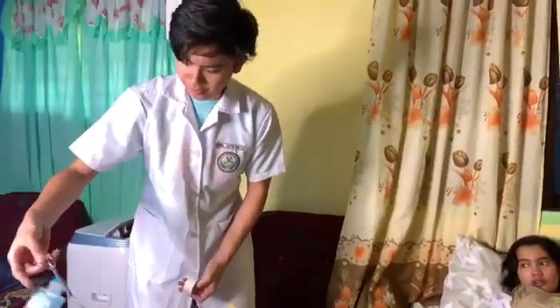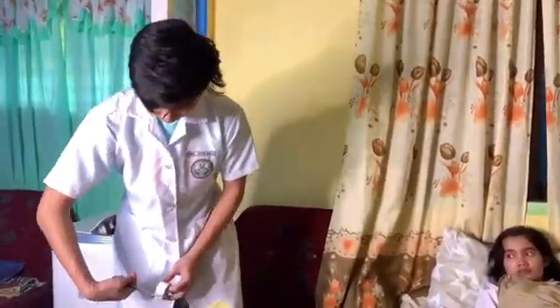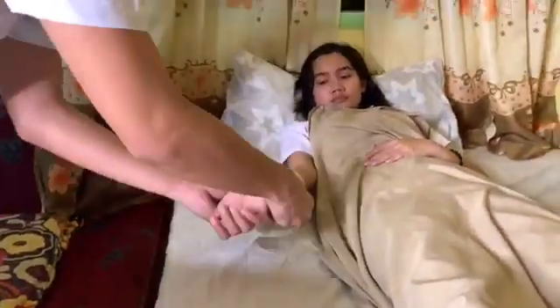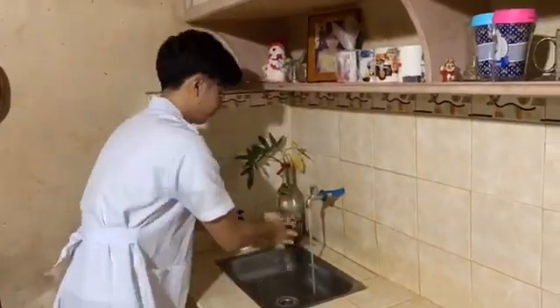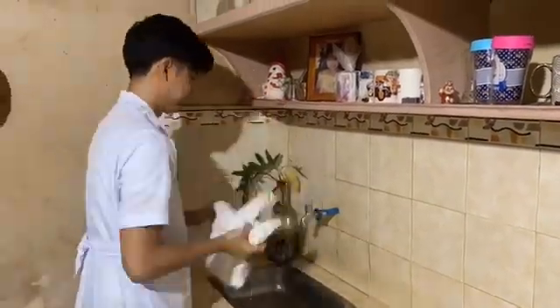Apply tapes or secure ties to keep the dressing in place. Tape is easier to apply after gloves have been removed. Then, remove all the equipment and make the client comfortable. Always remember, before and after every nursing procedure, we should wash our hands. So that is the proper wound dressing.